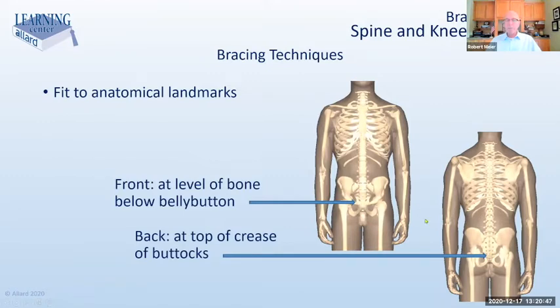Remember those two landmarks. If you're wearing any kind of back support at all, you can optimize the effectiveness of the brace if it's fit to those two landmarks.